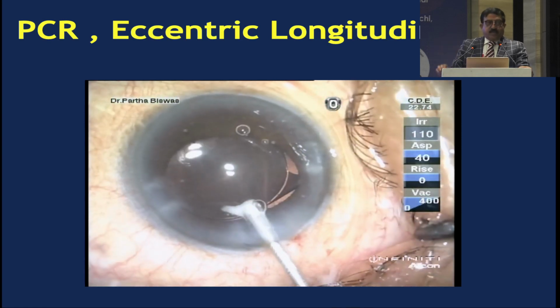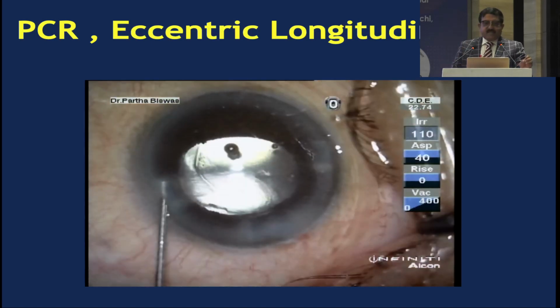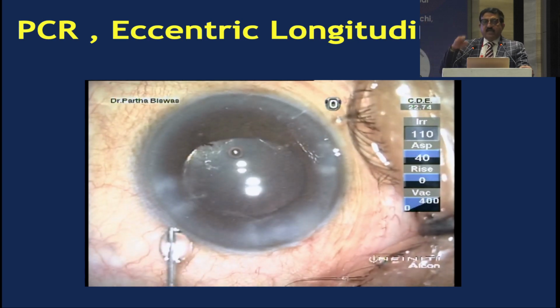So again, I would like to put a disclaimer. We show these cases, but it is not so that I can do this every time I have a PC rupture. Similarly, please assess the situation first, your own abilities first, and then go ahead. But it is always very important to be as safe as possible in a posterior capsular rupture.